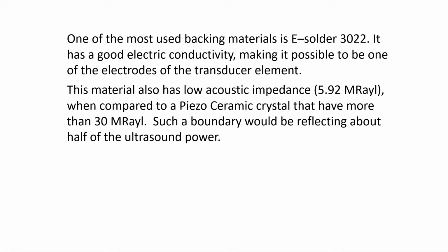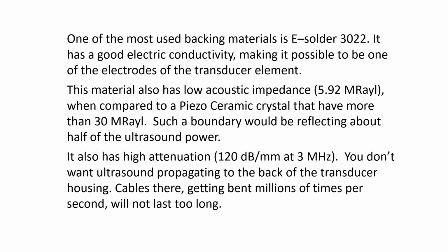Such a boundary would be reflecting about half of the ultrasound power. It also has high attenuation, 120 dB per millimeter at 3 MHz. You don't want ultrasound propagating to the back of the transducer housing. Cables there being bent millions of times per second will not last too long, right?